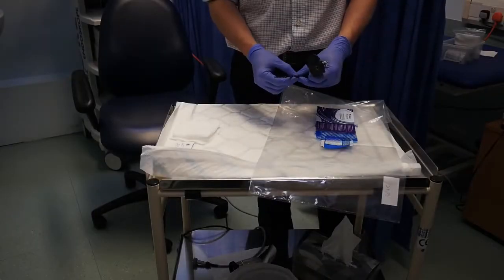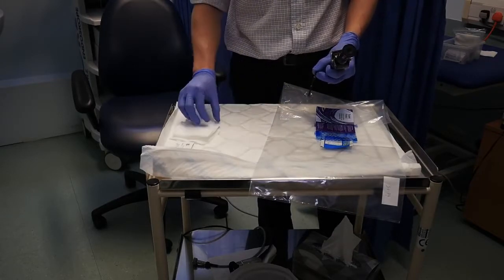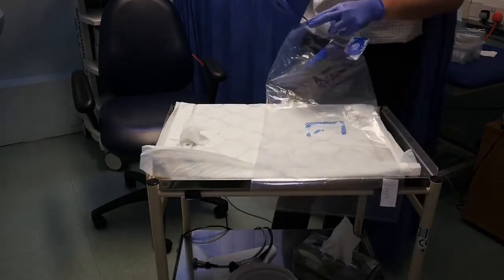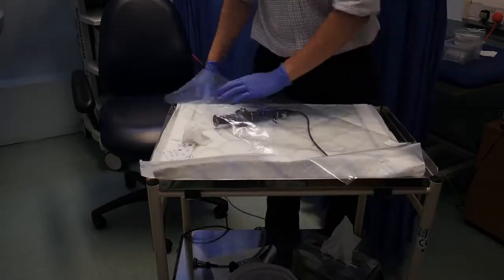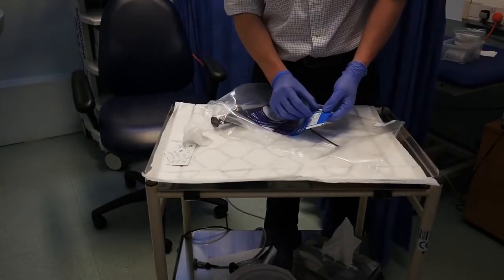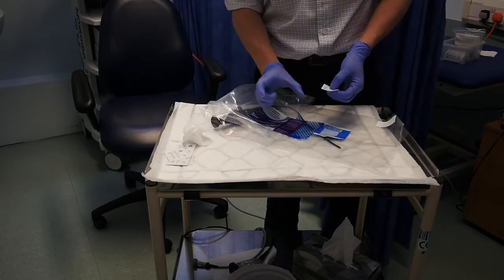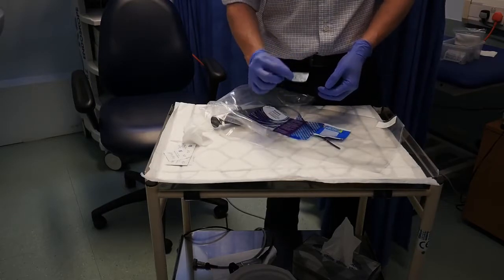Okay, so after you've used the scope, we've got to put it back into its bag, and it's important to check what the local policies are. So what I would normally do is just wipe off any excess lubricant on it. Insert it back into the bag and seal it. Most units now have an identification sticker over here, which goes into the case notes, as well as a tracking book. Often a patient identification sticker with a KI number would either be put onto the bag or onto a tracking book. Okay, but this goes into the case notes.